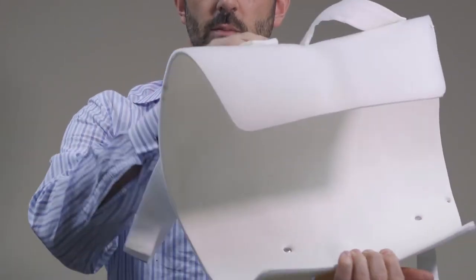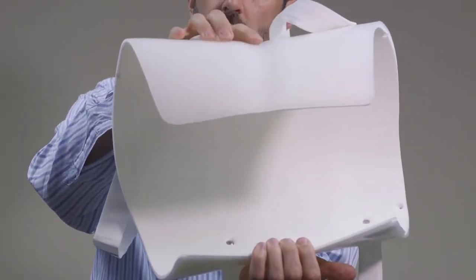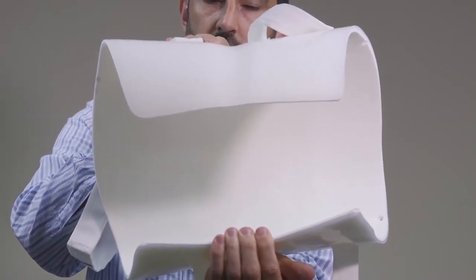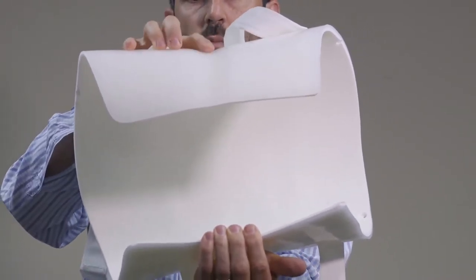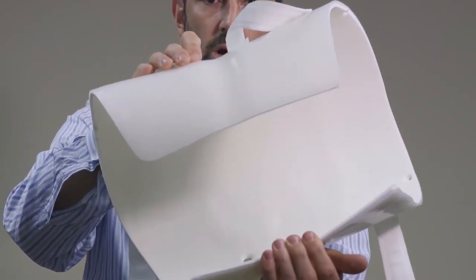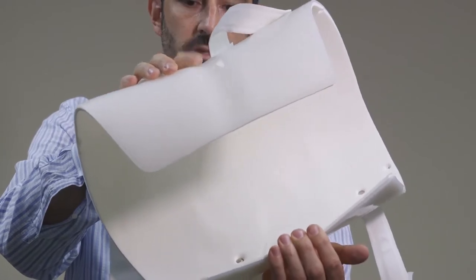If you also look at it from the outside, there's a little groove right there. It's not going to be this gigantic thing that jumps out at you, but it's an important part of the brace. Right here on the outside is also where you can see that groove.